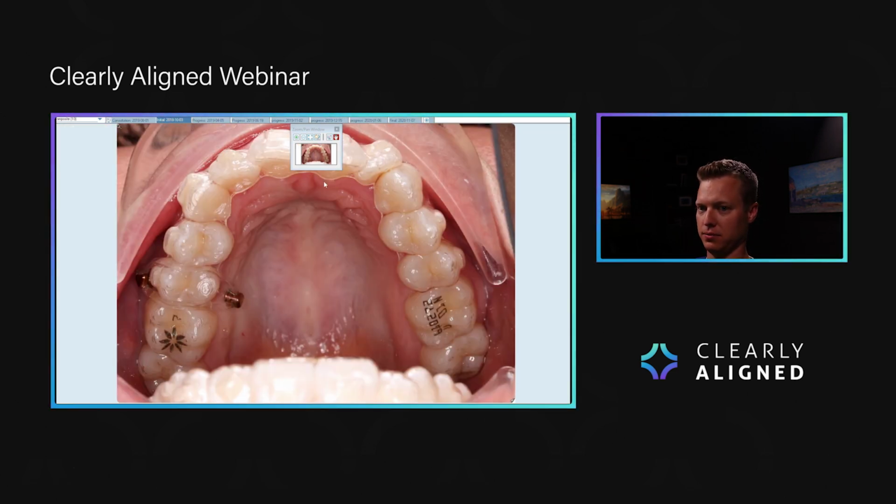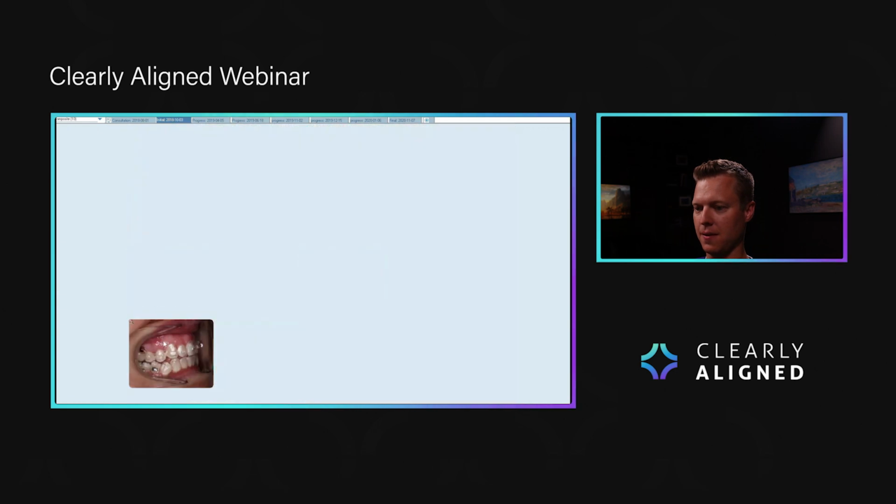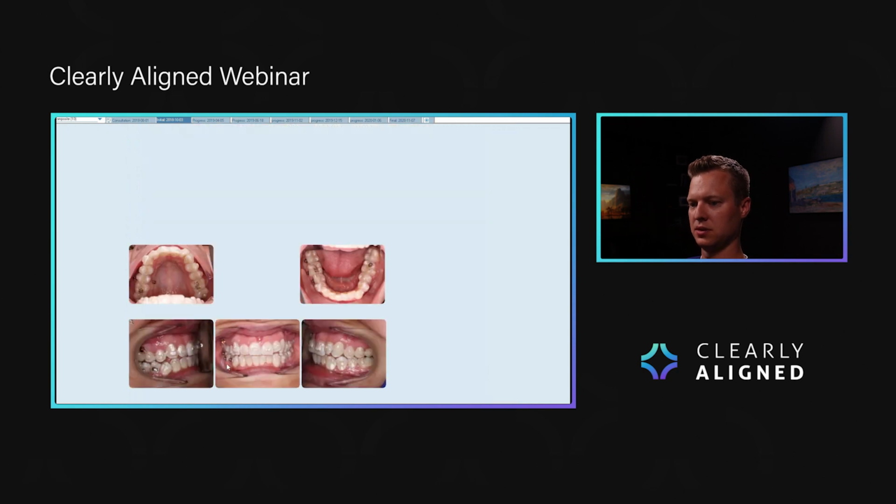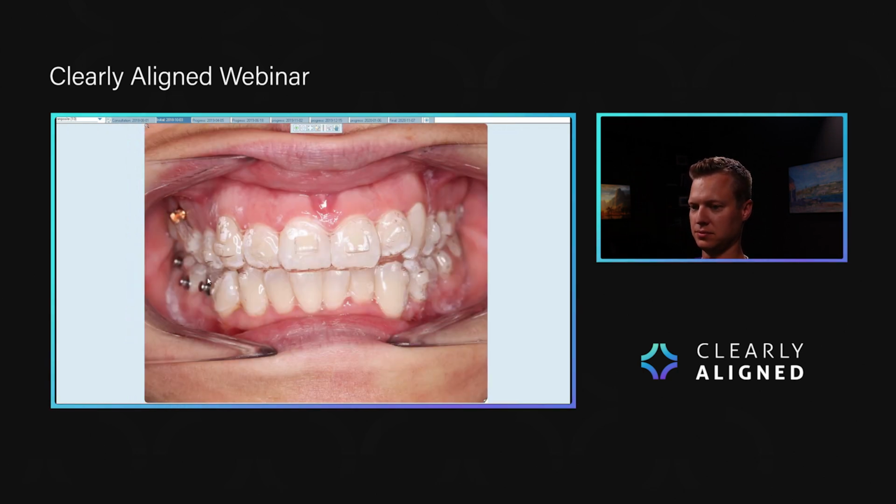So the tray gets put in, easy peasy, just like normal. Then the patient takes the elastic, hooks the elastic rubber band over top of the two TADs, and that pushes up against the tray to intrude those teeth. That's it. Then on the lower, well, we need to extrude those teeth.